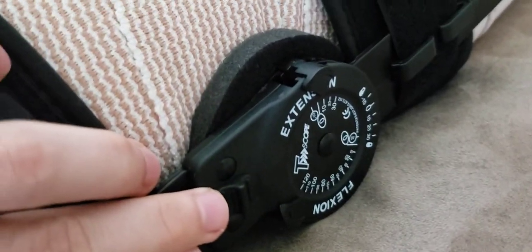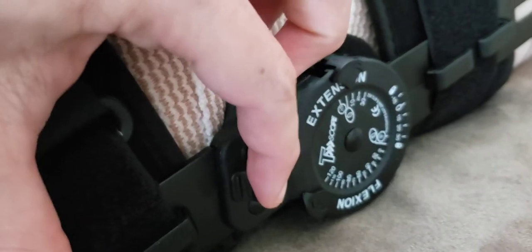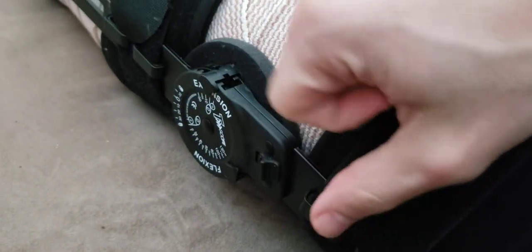This here is the locking tab, so I'm just going to pull this back — that's one — and do the same thing on the other side. There we go. Now you can actually see the mechanism in here moving just a bit, getting a few degrees of flexion.